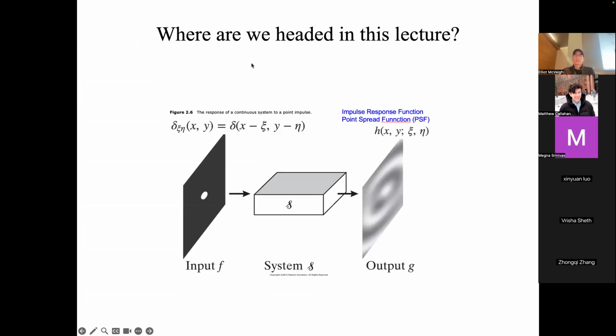And basically where we're headed with this is the following. Here's my input. This is my object creating signal. That input could be those X-rays coming out of the patient, hitting my detector. That's my input. Is that the image that's in the air right above my detector? That's the truth, right?